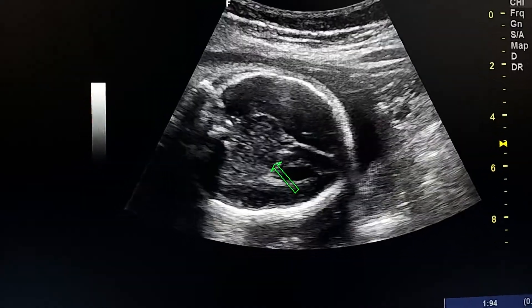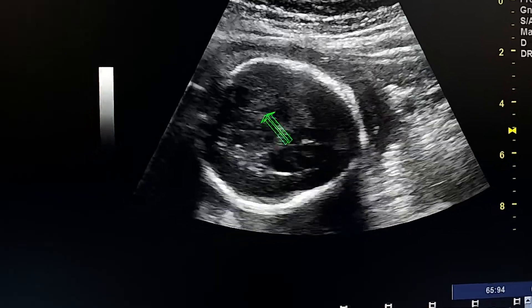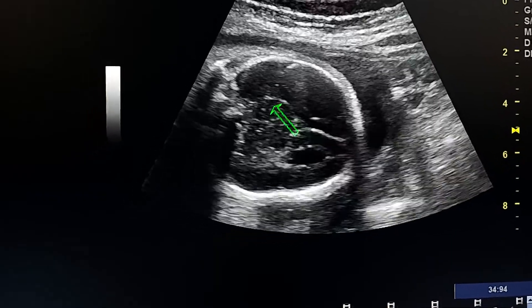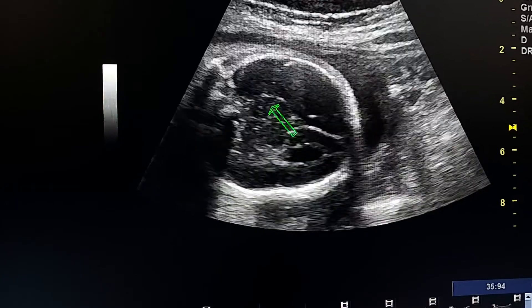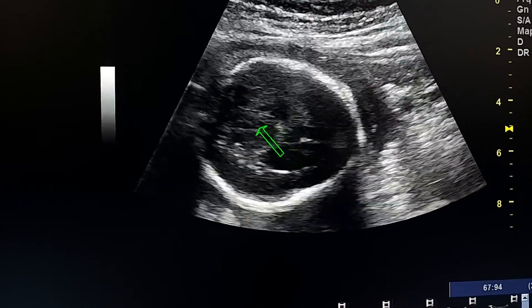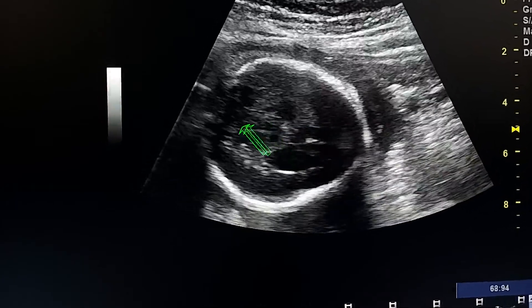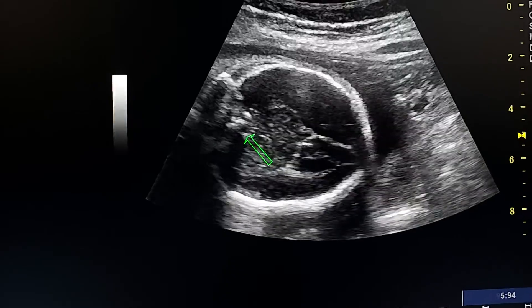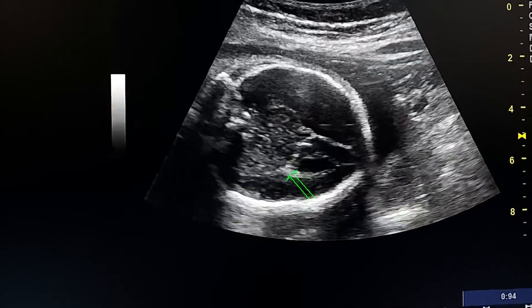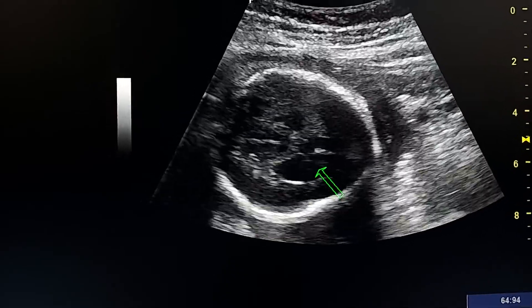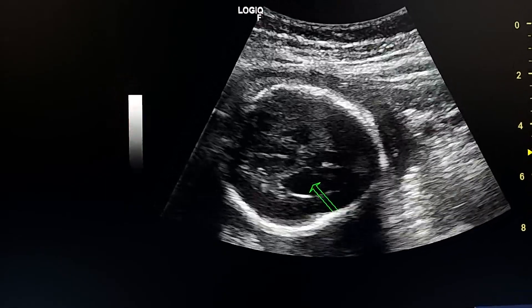Here we see the brain again. This is the fused thalami, absent cavum septum pellucidum anteriorly, and abnormal shape of the lateral ventricles.